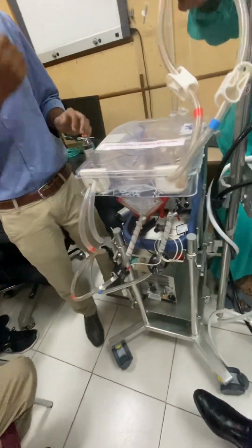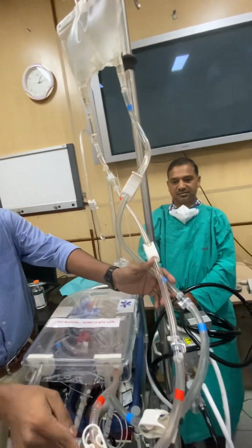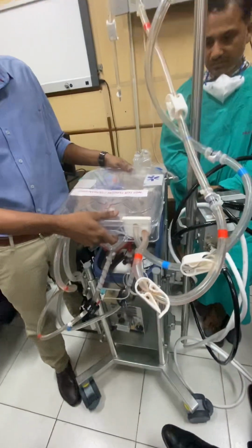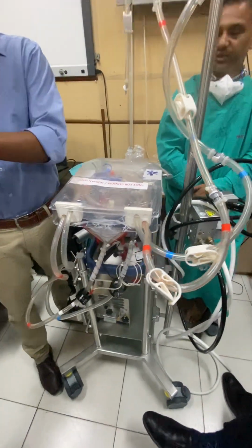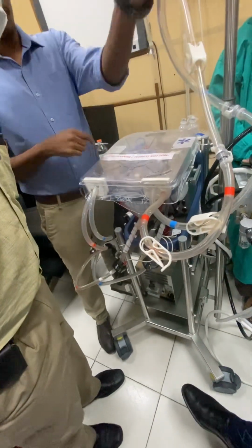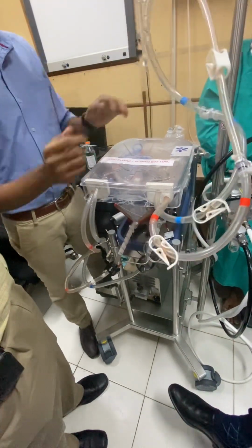Okay. So once you have connected it, as you can see, the bag is connected to the circuit, and this part always remains in the box because you want it sterile. You'll be passing this into the sterile field for connecting into the cannula. Once done, just open the venous and arterial.